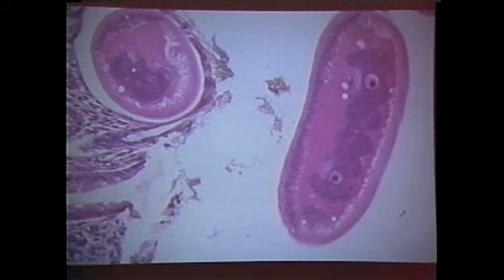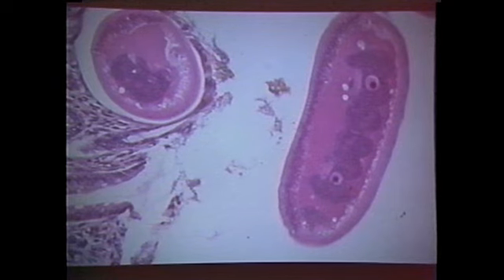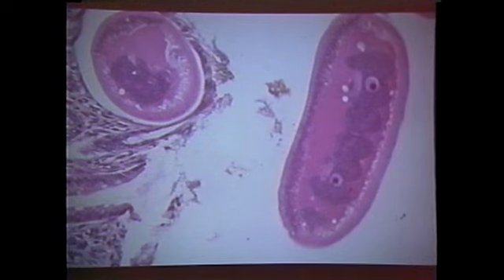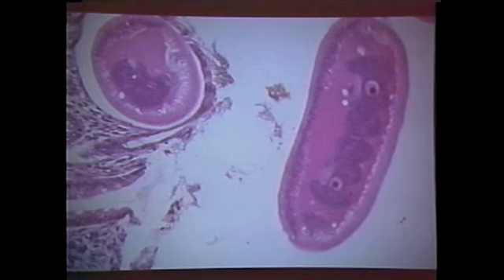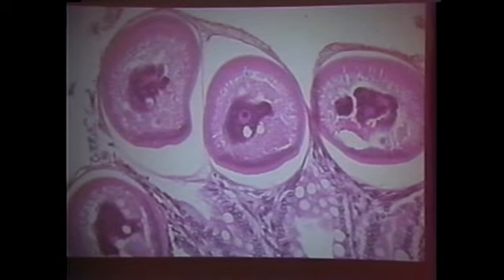Stichosomes are found in Trichuris, in Trichosomoides, in Capillaria. So you can use that. If you see a section with the stichosome, you can forget about the kind of muscles these things have. You know it's an aphasmid, and then go through your groups. All right? What kind of muscle? Well, it's coelomyarian muscle. Do we care? Not really. Let's talk about lateral cords.